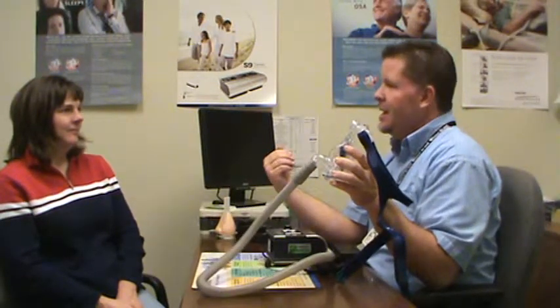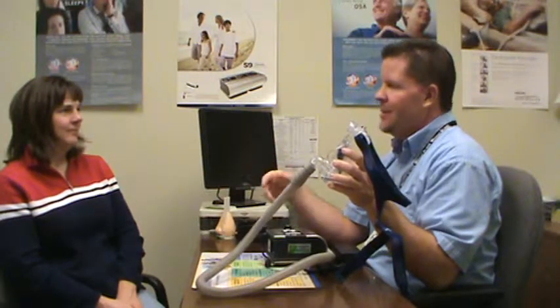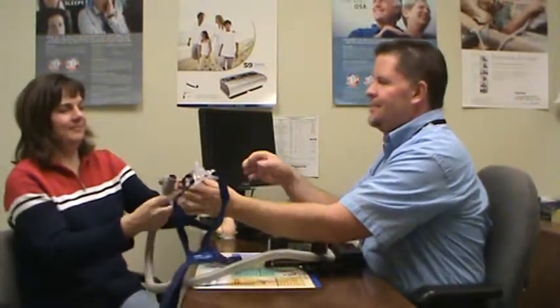This is nice because you don't have to take the whole mask off and then come back in the dark, half asleep, and try to connect everything back together and get the mask seated in the right place. It's a nice option. Why don't you go ahead and go through that for me. Slow and steady wins the race. Very nice. Very well done. I think you're a pro.